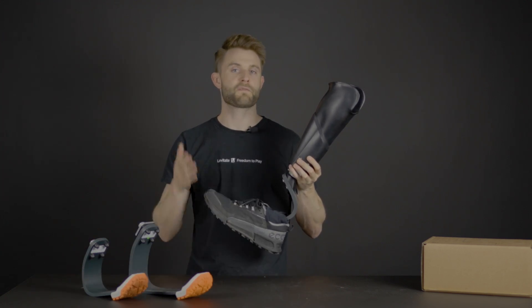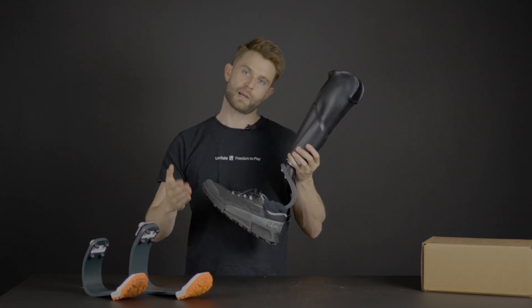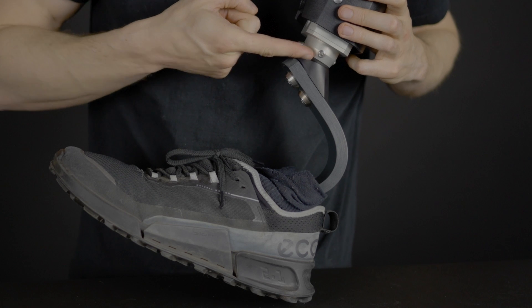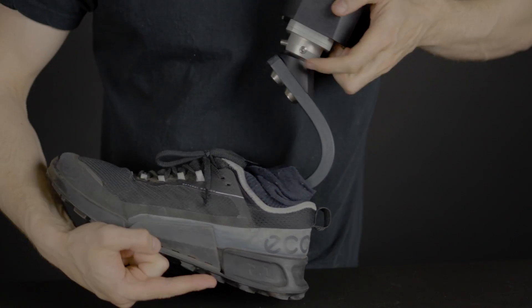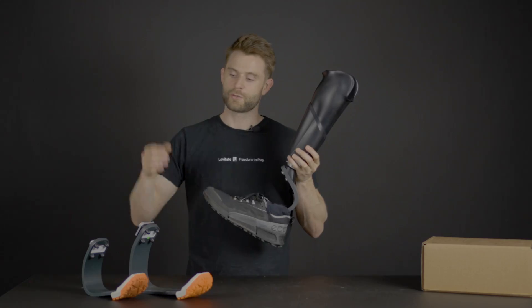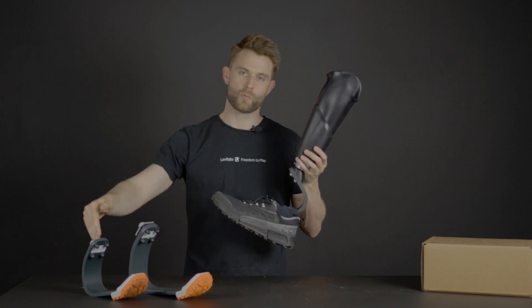To find the running blade that fits your leg, you need to measure your clearance. Your clearance is the measurement from below the socket to the bottom of your running shoe. If you have more than nine and a half inches, you need the blade two. If you have less than nine and a half inches, you need the blade one.